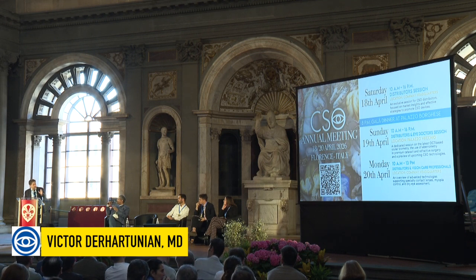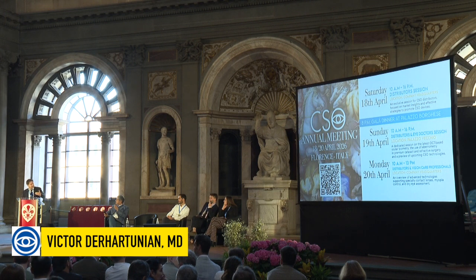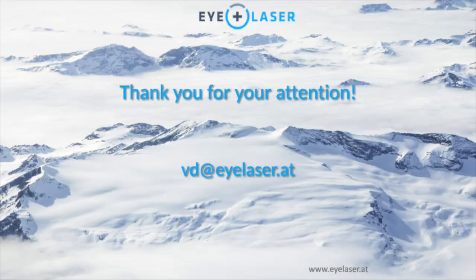Yes. You have all-in-one. Basically, after performing the biometry with the device, you get immediately 4 formulas. I can show it to you. And then there is another option that you can calculate the lens with ray tracing. Then basically what I do is take screenshots. You can compare them, and you can see if there is agreement or not. And then you can choose your IOL. It's a very nice overview.